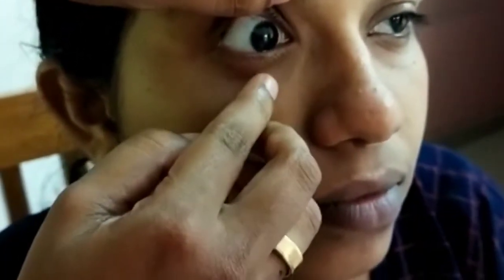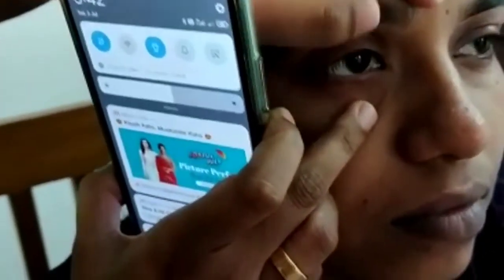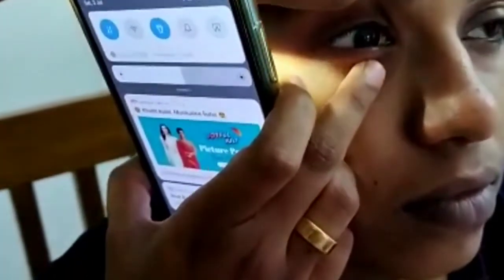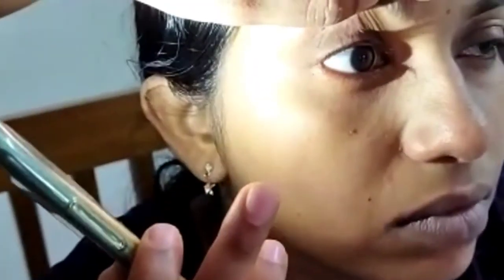For centration, the lens should be centered, extending an equal distance beyond the limbus in all directions — that confirms a perfect centration. For movement, we use the push-up test. The patient looks straight ahead, and we push the lens up vertically by applying pressure on the lower lid, estimating how the lens moves upward and the smoothness by which it returns. The ideal fitting lens will displace easily and return smoothly.